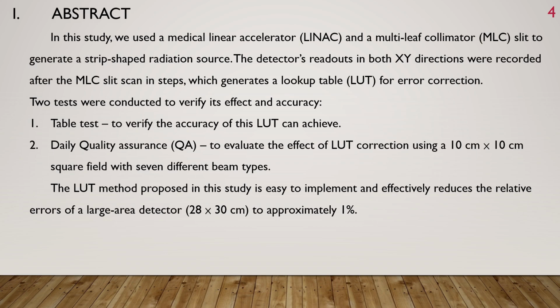Daily QA test to evaluate the effect of LUT correction using a 10 by 10 cm square field with 7 different beam types. Results showed that our LUT-based method is easy to implement and effectively reduces detector errors to approximately 1% for a 28 by 30 cm area.